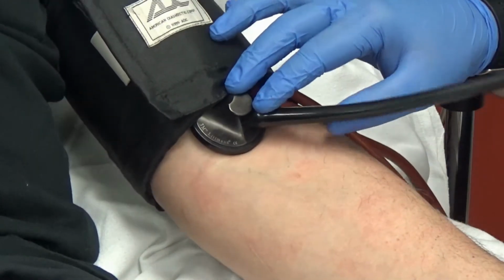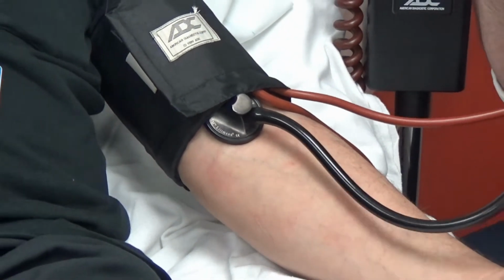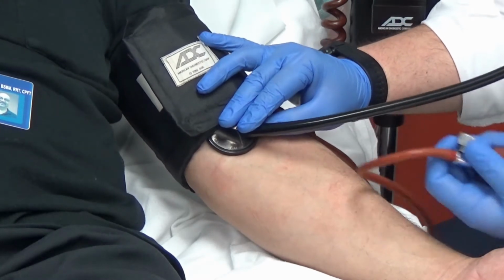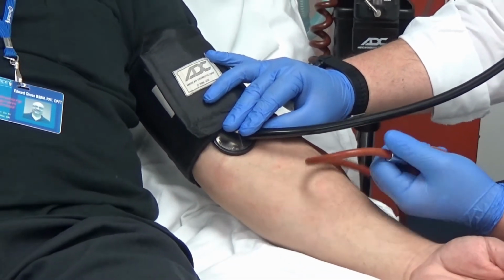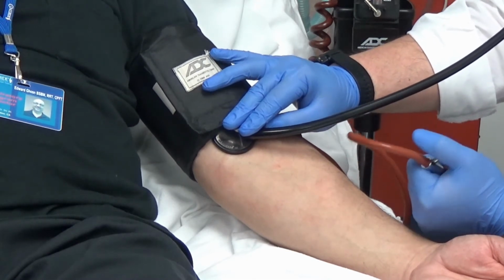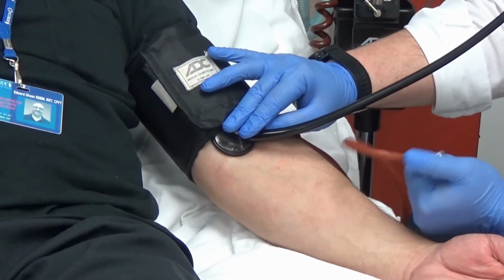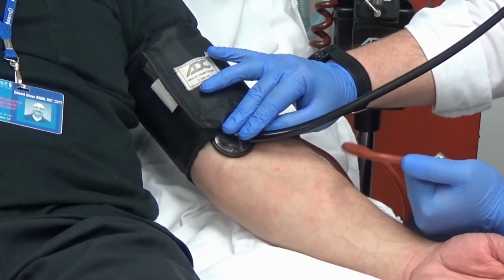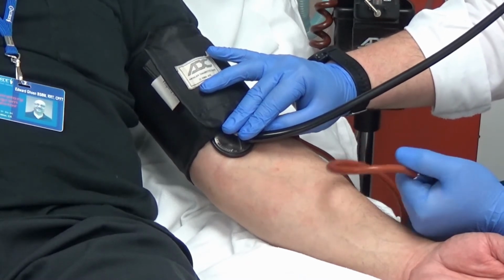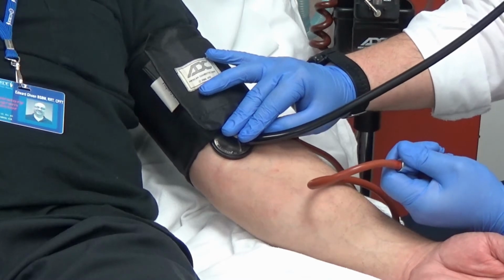So basically, the reason the stethoscope is so important is because this is where you're going to listen to your systolic and diastolic pulse, okay? Typically I'll make sure that this bulb is closed, the cuff is closed, and I'll pump this up to 180. 160 to 180 is usually a good enough range. And then you want to slowly start releasing it.